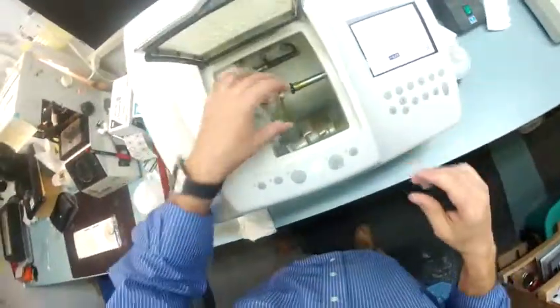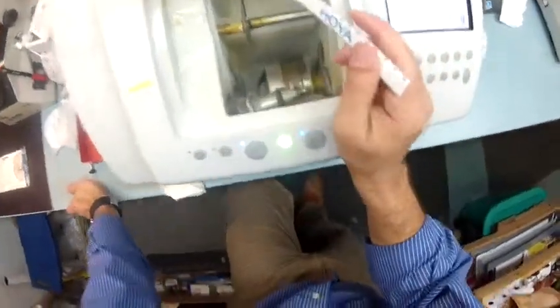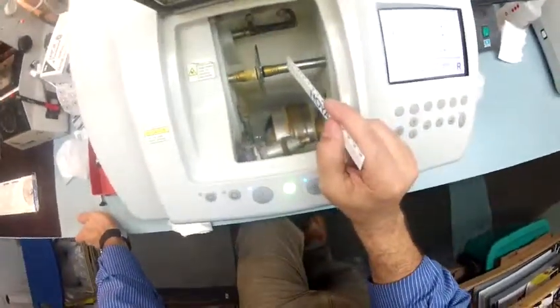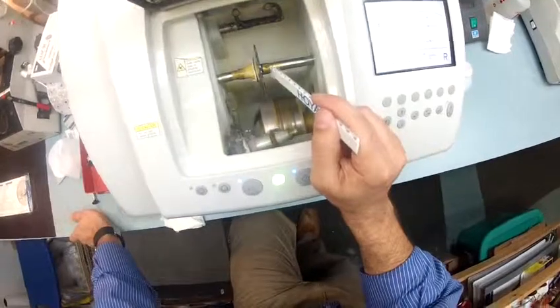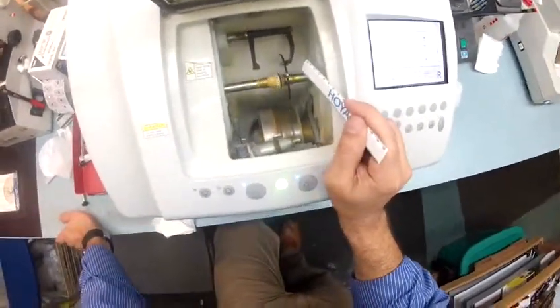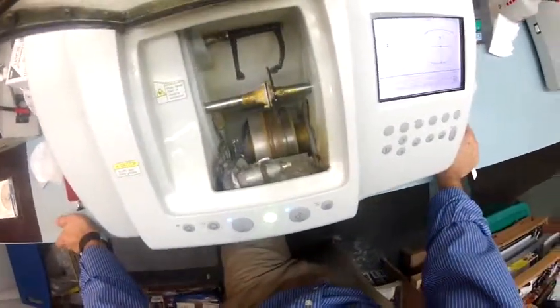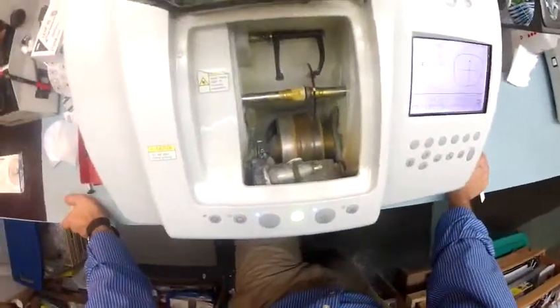I'm going to take this lens and put it into the chuck — or as I like to say, the Charles, because I don't know it well enough to call it chuck. The calipers are going to come down and trace the back surface, the concave side closest to your eyelashes first. Then it's going to move over and trace the front surface, which is the convex surface. That will be the end of your vocabulary lesson today.